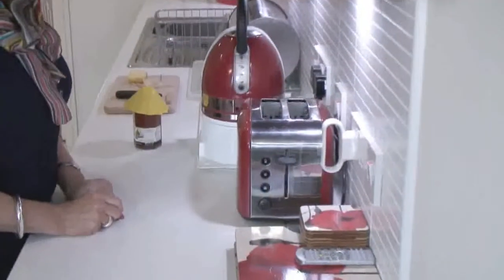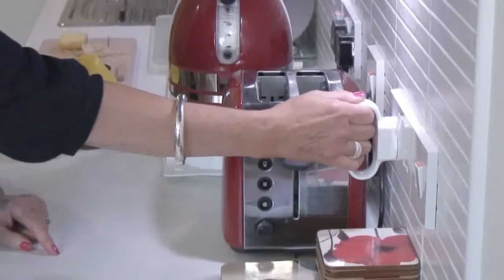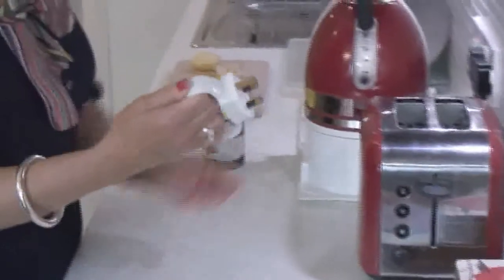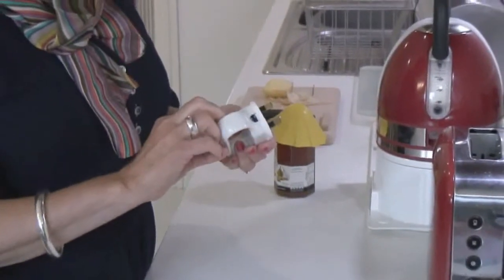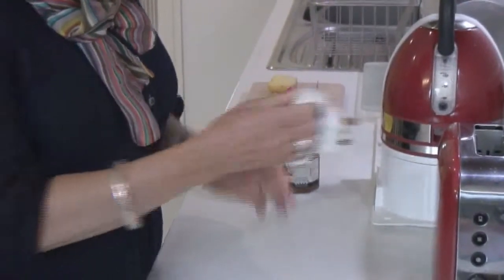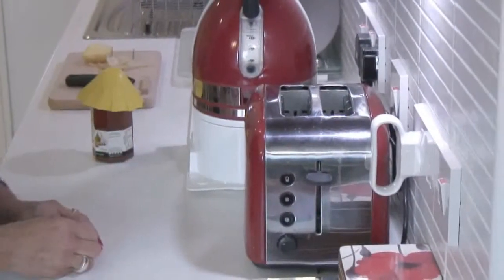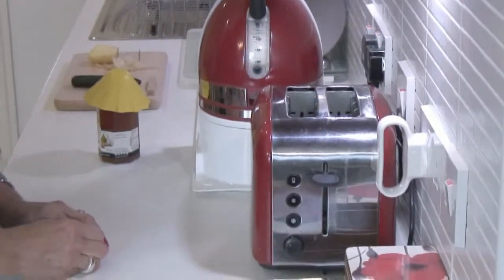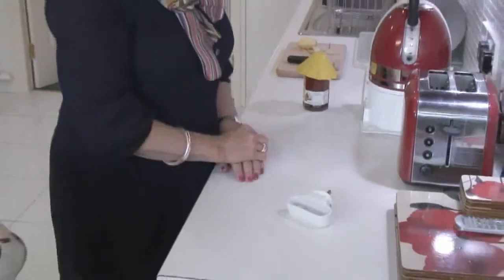Moving on from that, another item again where you have limited hand function, where your joints are painful. Often it can be difficult to get a standard plug in and out of the wall. These plugs can be changed from the standard plug on any appliance, and what these have is a handle on them which allows you to grip, a much wider grip, to pull the plug in and out of the wall.